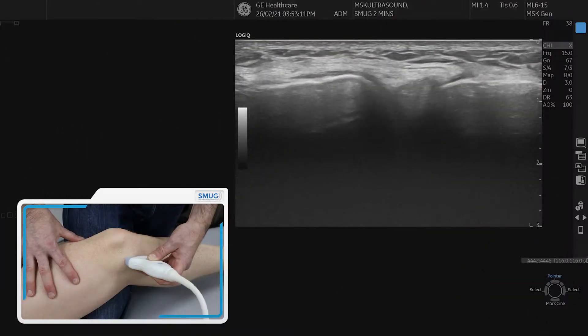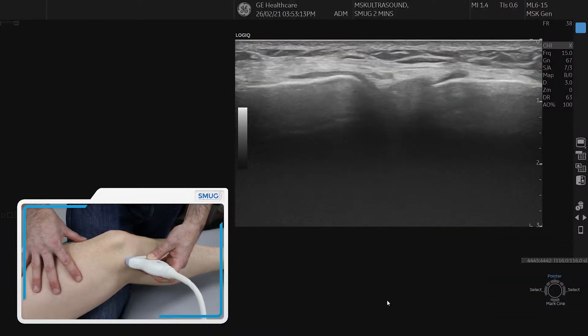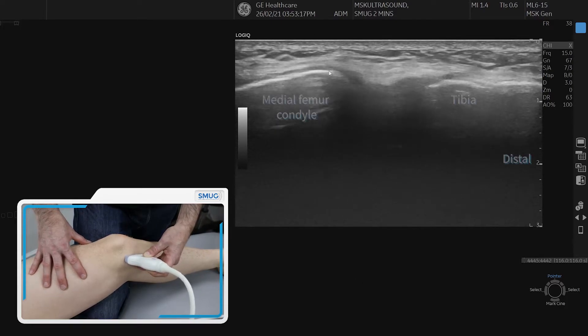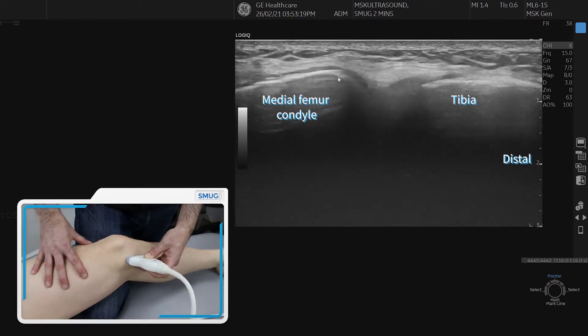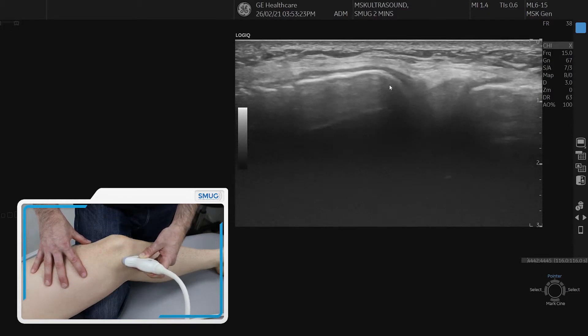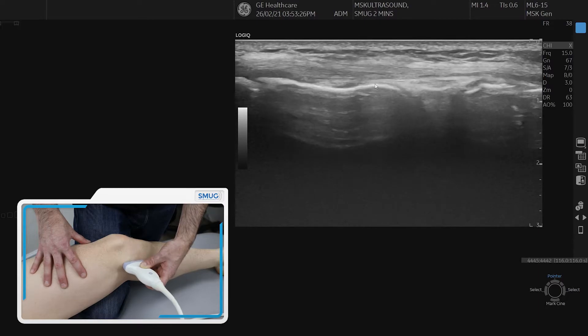We're going to go over the MCL. To start with, we put the probe over the medial joint line and identify the femur, which is on the left side of the picture, and the tibia, which is on the right side of the picture.